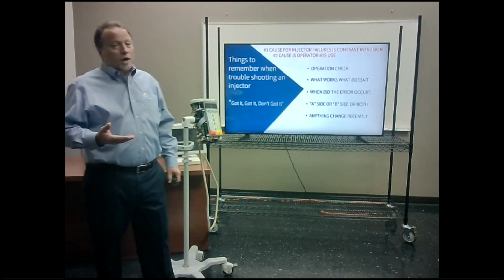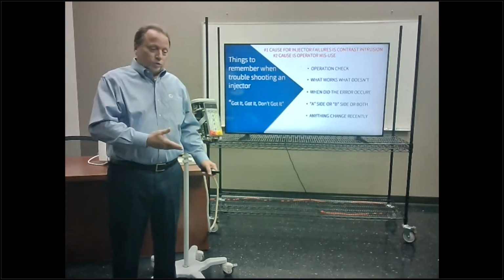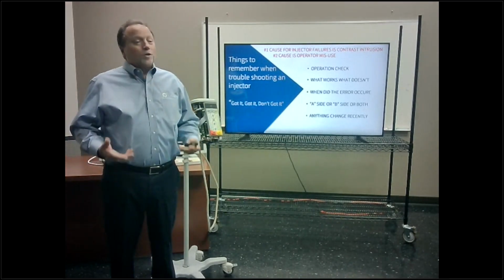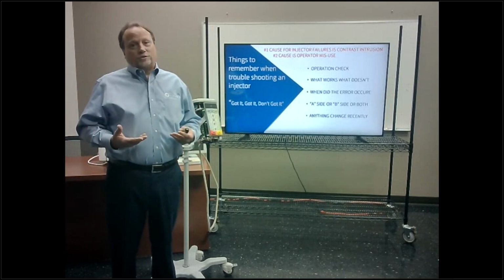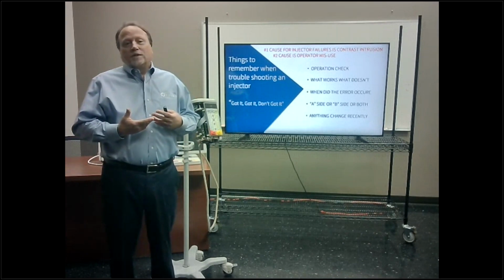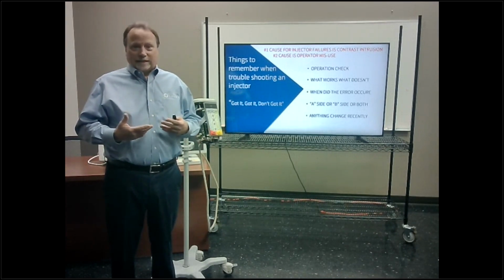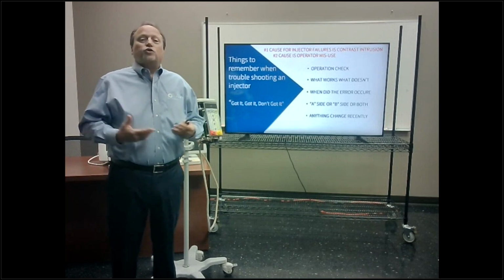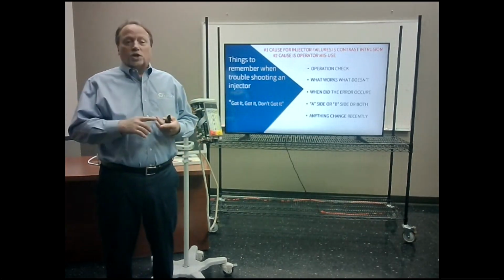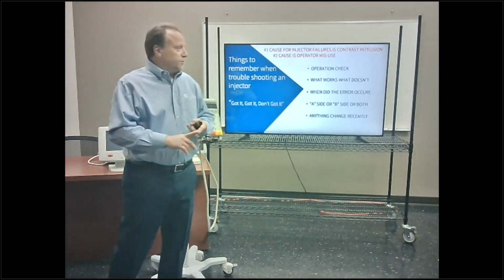The number two cause, and I hate to say this, is operator misuse. Now, I'm not saying they do it deliberately, but they do damage the injectors. Either they run into the wall, into the overhang, or even crush the table on them. That can happen. So those are your two major causes of issues with any injector: contrast intrusion and user abuse or misuse.